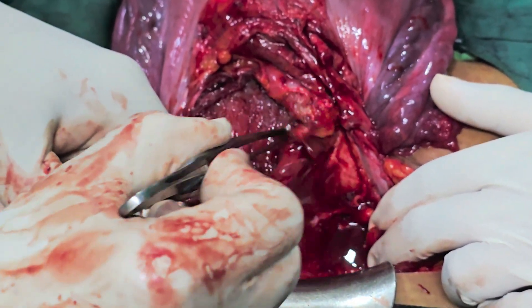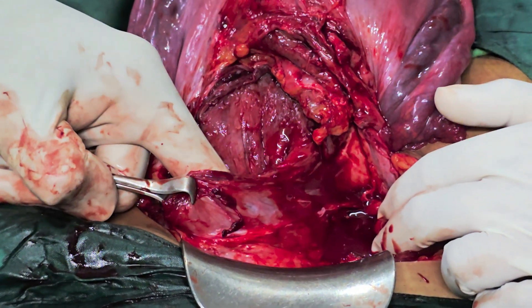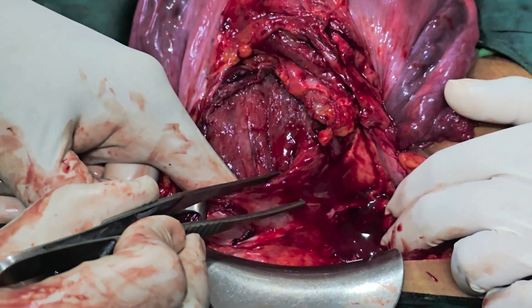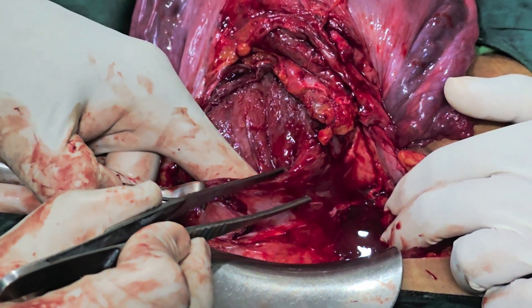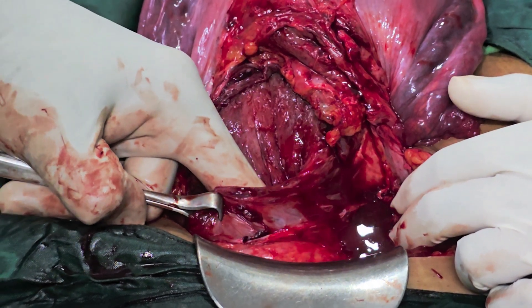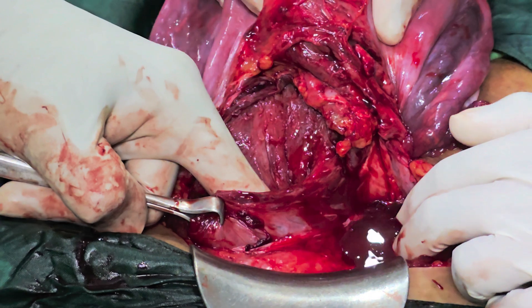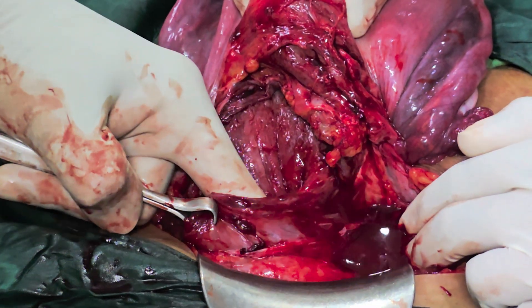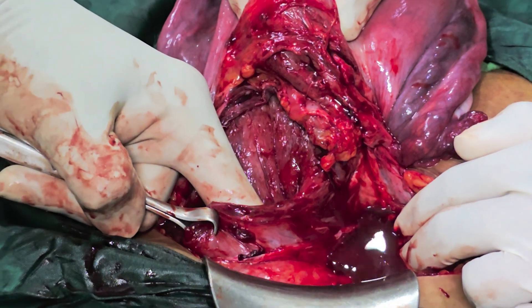Effectively, it will stop the blood that is coming into the lower segment. This is not a case of placenta previa but we are doing it as a demonstration stitch. Ideally, you should practice all these techniques where they are not indicated so that you are ready when there is an emergency and you should not keep on fumbling as to how to do this stitch.